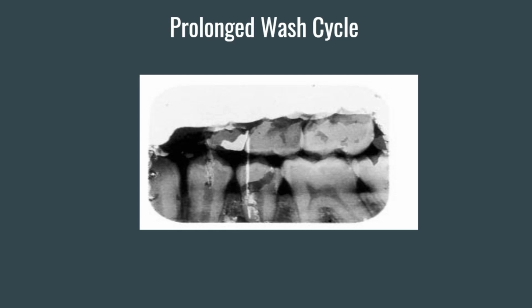This is a film that had a prolonged wash cycle. So it was left in the wash too long. It was left in that water for too long and it has washed away too many crystals. And so what we're left with is this sort of broken down, kind of sloppy looking, distorted film.